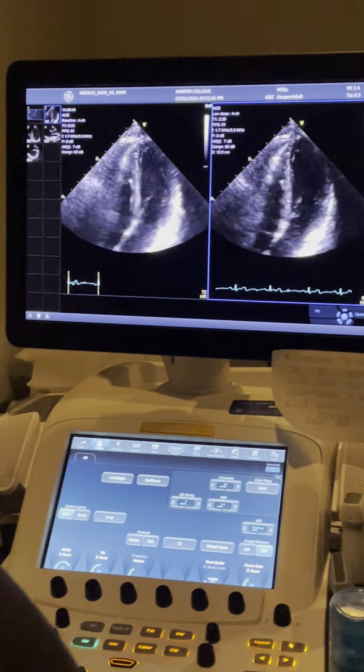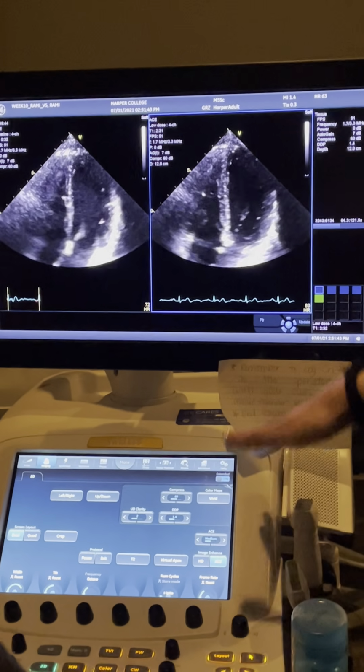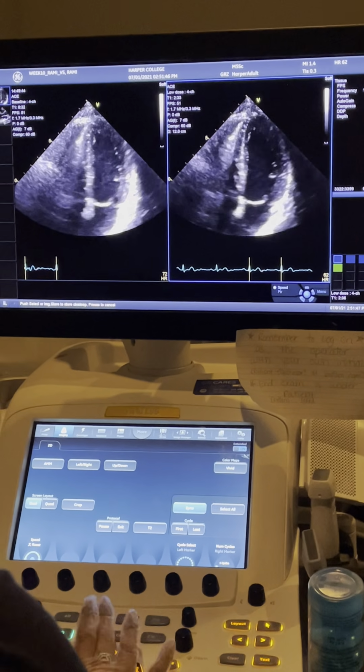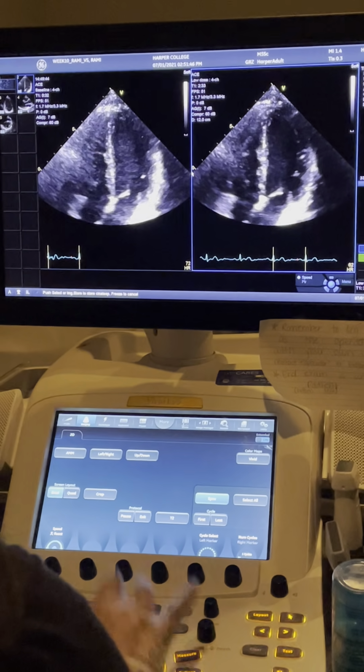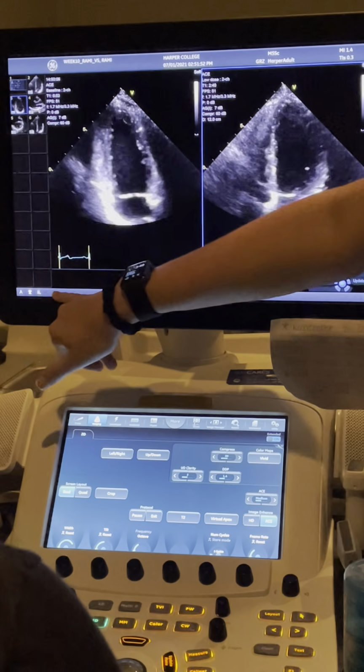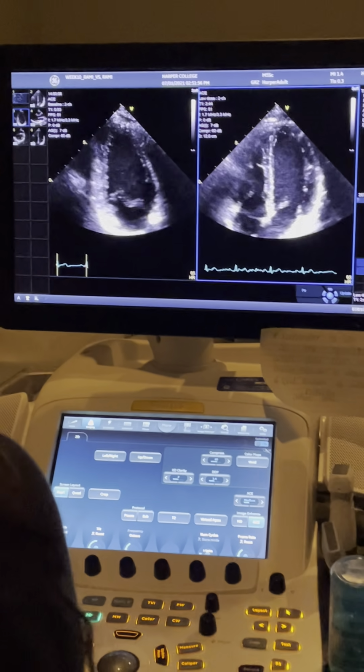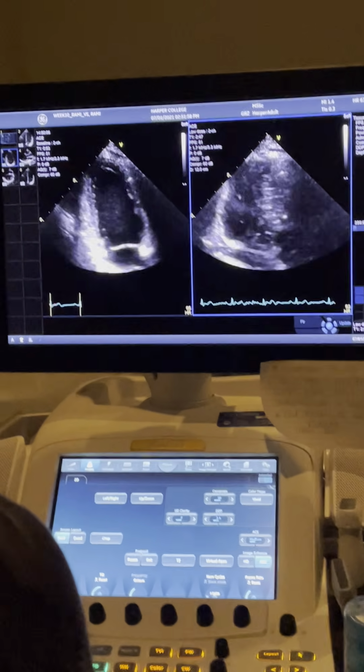So we'll go ahead and acquire our low dose here. We'll pretend her heart rate ticked up a little bit. And select the same? Yep, same way. Select if you want to keep it and freeze to cancel. And it will almost always have the instructions here if you're ever like, wait, what do I do now? That's the nice thing about the GE. And then we'll get a 2.